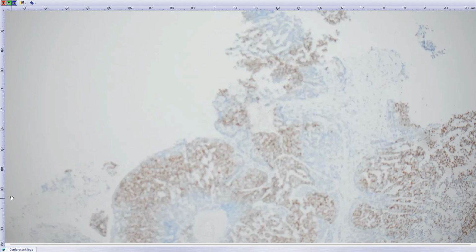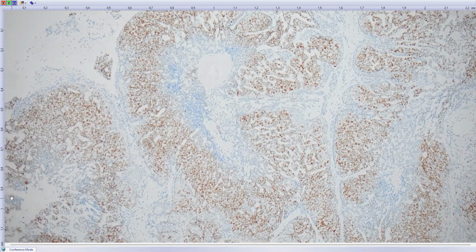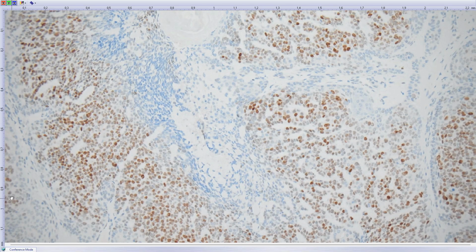And if we did not know that it's a surrogate marker which is not reliable, I believe that we would like to say yes, it's adenoid-cystic, but it's not. It's just positive. Immunohistochemistry is positive, but the molecular testing was negative.